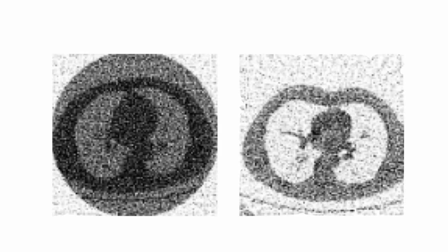If we don't use our knowledge that a priori single color images are more likely than images with pixels jumping between black and white, we are not able to obtain high quality reconstructions. So in order to obtain good reconstructions, we need to put this additional knowledge into our reconstruction. Here are some examples of the images that we obtain in very low dose computed tomography if we don't put this additional knowledge in.